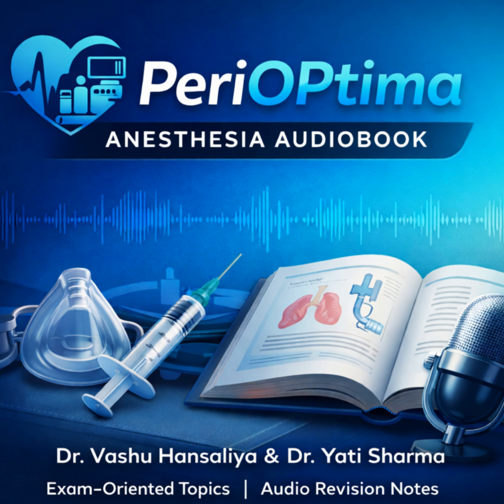Section 21, summary and exam conclusion. Let's wrap up with the final high-yield take-home points for the exam hall. Okay, here's the rapid-fire recap. 1. IABP increases supply through diastolic augmentation and decreases demand through systolic unloading. 2. Timing is key. Inflation at the dicrotic notch, deflation just before systole. 3. The absolute contraindication for IABP is aortic regurgitation.